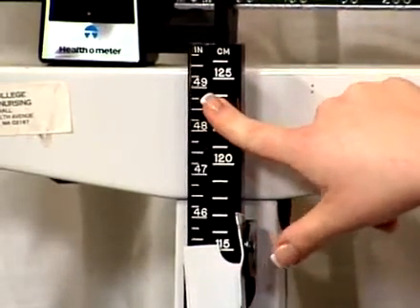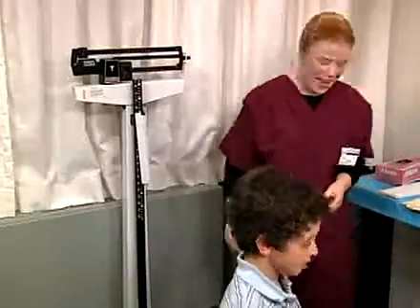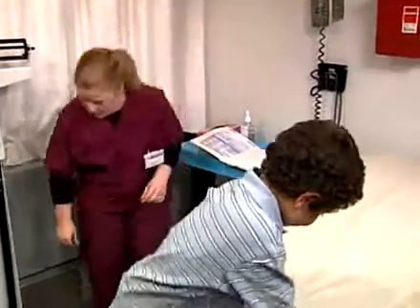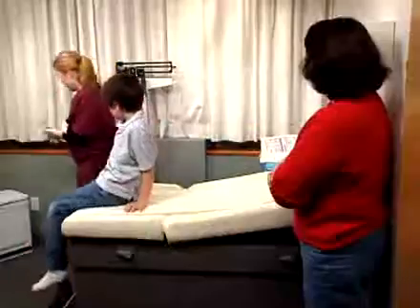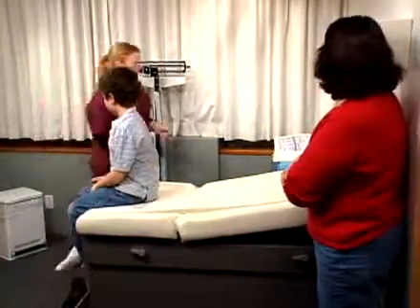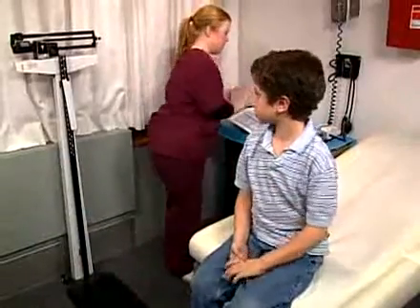Read the result. He was 49 inches tall. Be sure to lower the horizontal measuring arm before leaving the scale. Clean the measuring bar with an antiseptic wipe. Sanitize your hands and document the measurements.